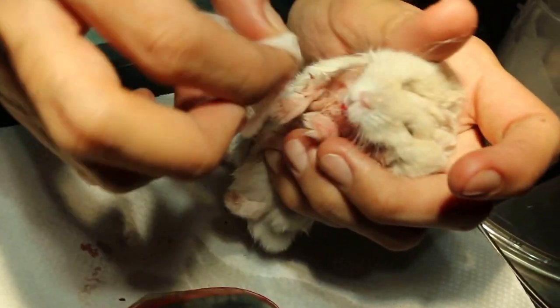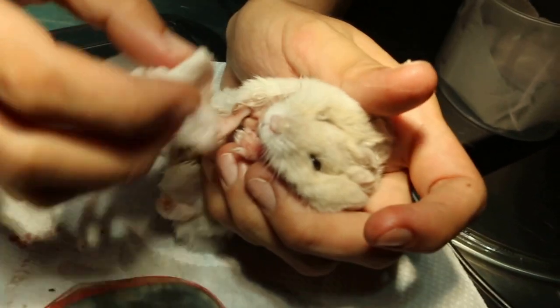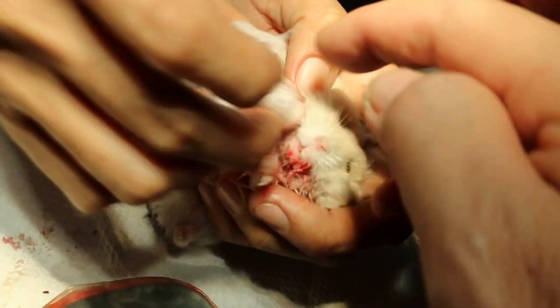A bit more, firmer. You see, such a little bit of anesthetic and he's already down. This shows that he's not very fit. Two years old hamster, just with it.